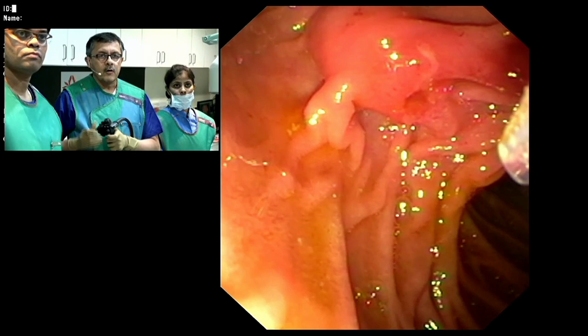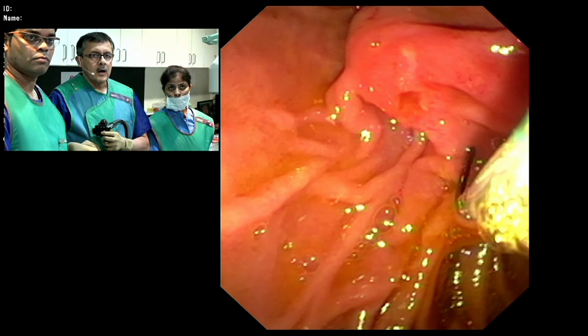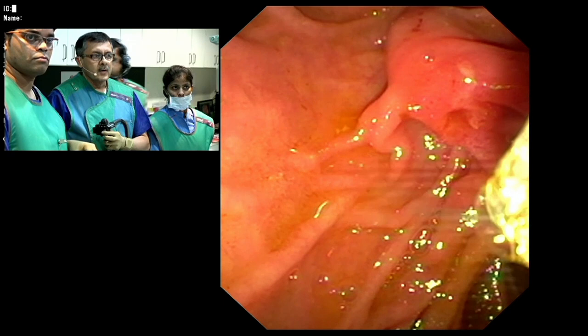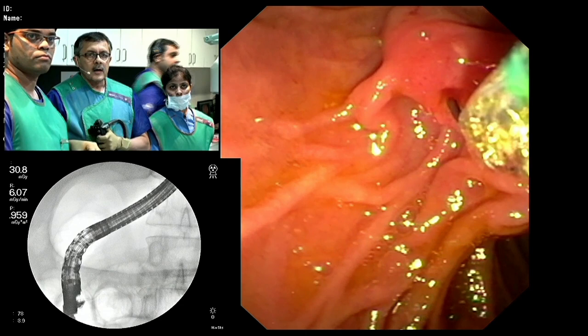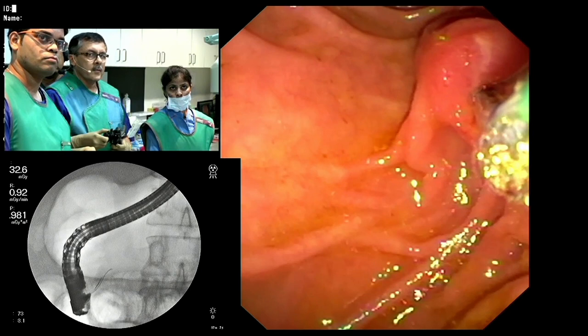So I'm cannulating the bile duct, turning the small wheel to the right. Now my assistant is going to show you how we may take the help of this easily rotatable glide wire. So this is the Terumo wire, 0.032, and I usually do a wire-guided cannulation. So go inside, and then I'm bending the sphincterotome a bit, and now I turn the small wheel to the right to bring the sphincterotome towards the axis of the CBD.